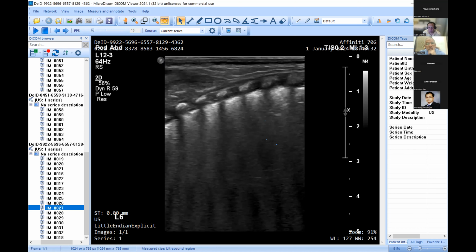You'd be surprised how PIE can give you this appearance that Naveen is showing us in this slide. You can get exactly this image in a baby who has deteriorated, FiO2 has gone up from 50 to 80%, and you think, well, it's just a B profile with compact B lines. The pleura looks a little bit irregular. So the question is, should I start diuretics? And you do a chest X-ray and you've got horrible PIE. And if it's one lung, the management would change completely. You'd nurse with that side down.